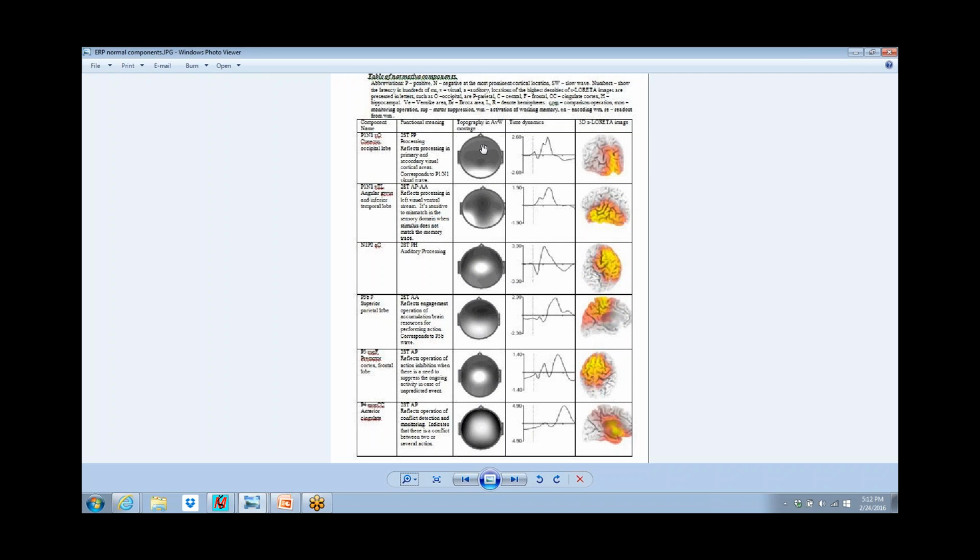And we can watch the progress of this stimulus all the way through to the motor response, or lack of motor response if you're supposed to inhibit, and then whether the person sees their response as being a correct response or if they get what's essentially a mismatch, which is an error code. So you watch the perception, the processing, the motor engagement or inhibition, and the awareness of whether the response was correct or not, all within 400 milliseconds.